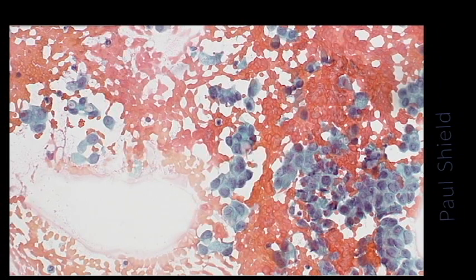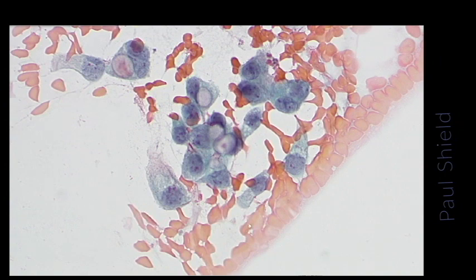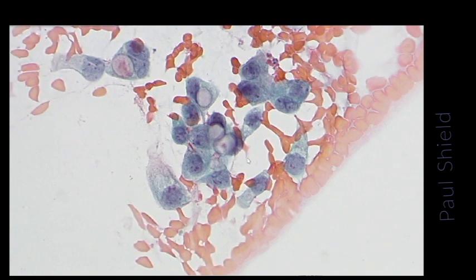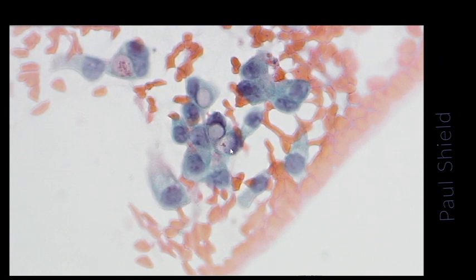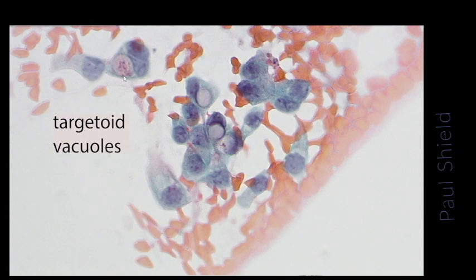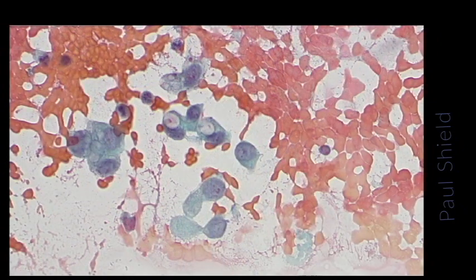There's a little strip of cells, notice the nuclei again all around the outside, and looking on high power you can see that vacuolation, and I'm just pointing at columnar cells here. These vacuoles here that you can see are clear with quite a hard edge to them, and a little dot of material inside some of them if you focus up and down. This one's got some, and that's what we call a targetoid vacuole. It's seen in well differentiated adenocarcinomas, so they're producing mucin, and this group here you can see have nice targetoid vacuoles.